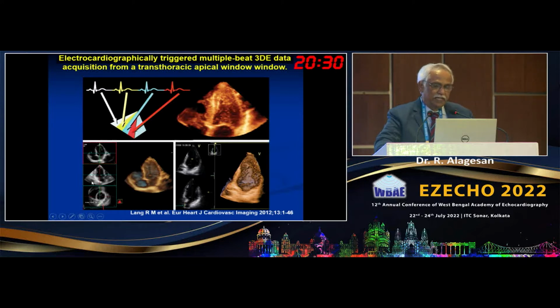So look at the two-dimensional echocardiographic data sets, and when you are convinced that they include the entire left ventricle, and the two-dimensional data set is clear enough to include all the endocardium, then go ahead and capture the full volume data. So this is extremely important, because the better your 2D, the better will be the 3D.